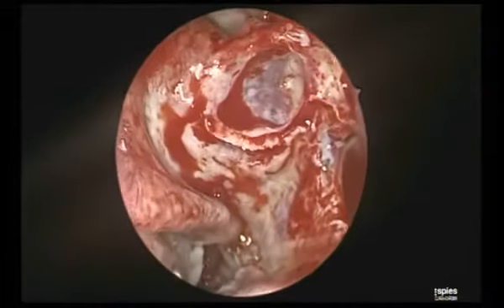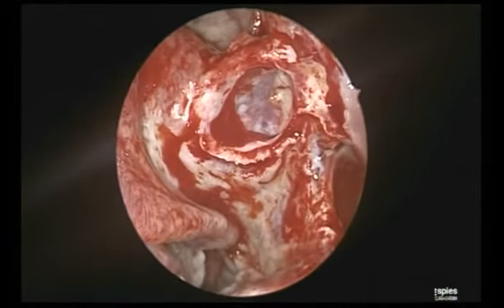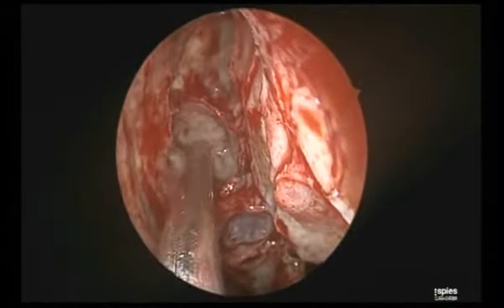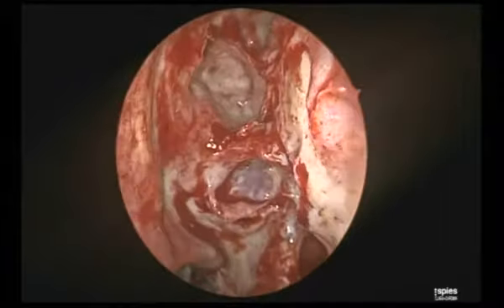So between the ground lamella superior attachment and the anterior ethmoidal artery, is there always one cell, or are there many more cells? No, there is as such no cell. This is the space. There will be no cell. You will always see it like this. In all our cases, I am going to show this. This is one of the most important landmarks.